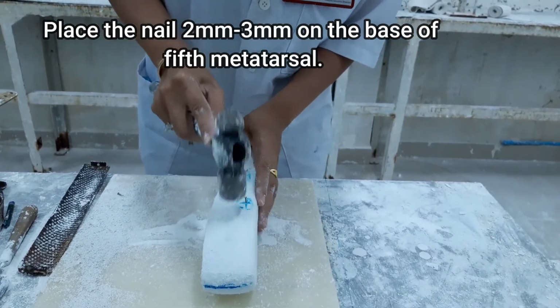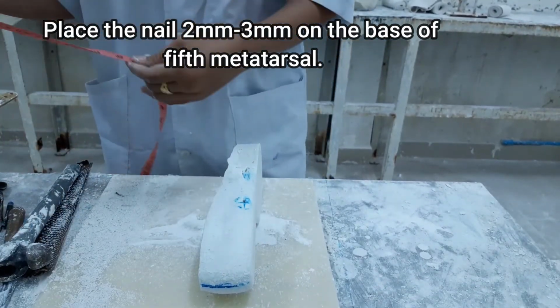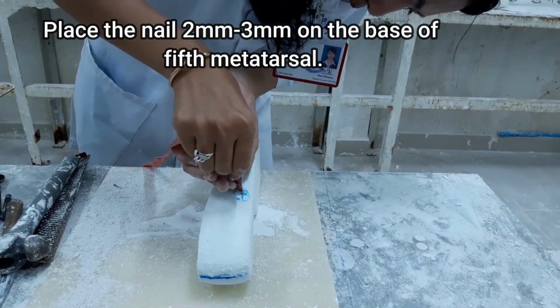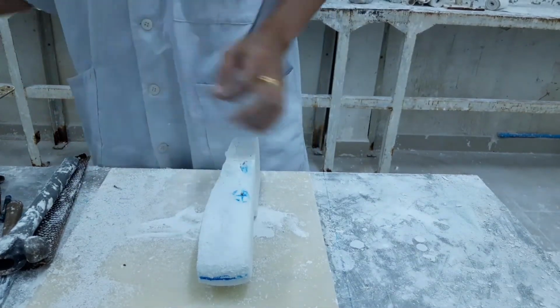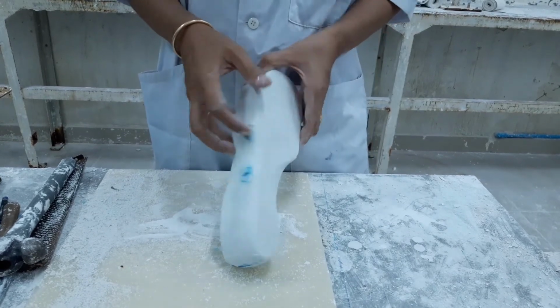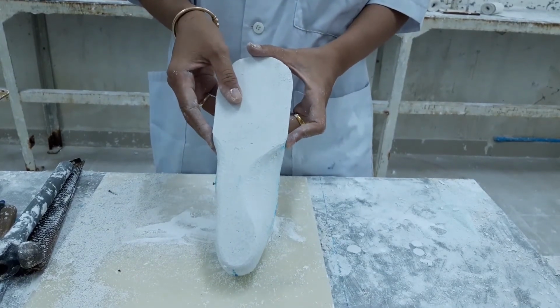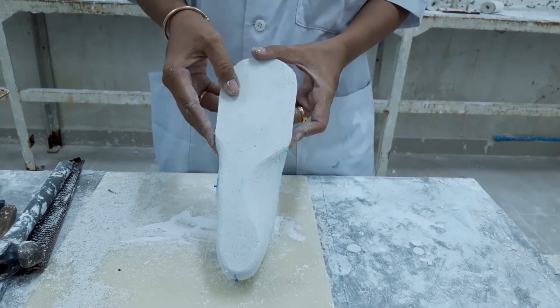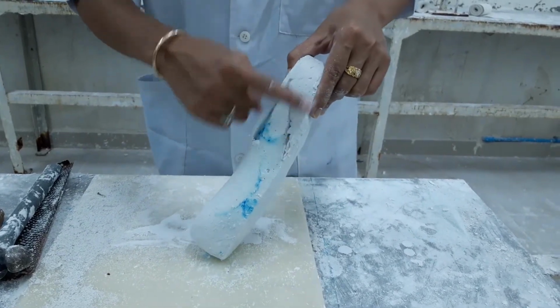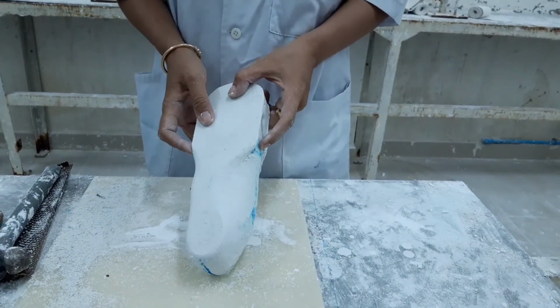So I put the nails to identify where it is located, and then I'm able to understand how much I'm going to build up. It's about 2 millimeters. Okay. And for the fifth metatarsal head and the first metatarsal head, we are also going to build it up. But when I measure my diameter, it is already bigger by about 0.2 centimeters. Okay. So just slightly build it up. When we build it up, it is almost 2 millimeters each side, so about 4 millimeters.